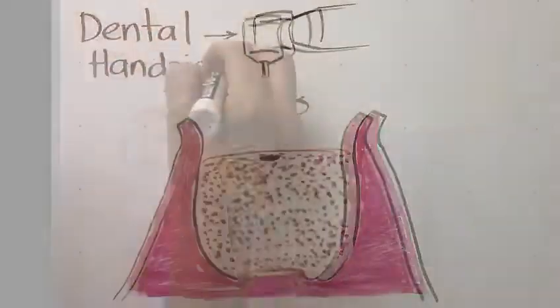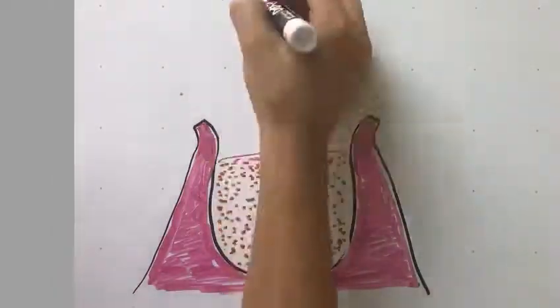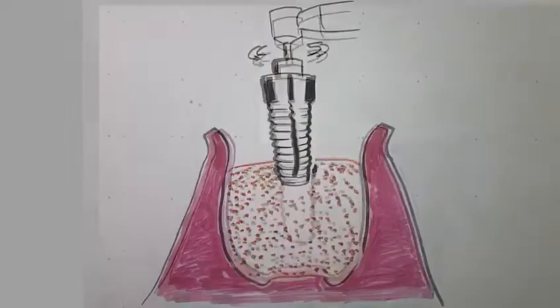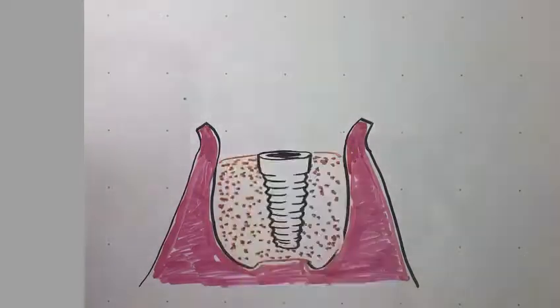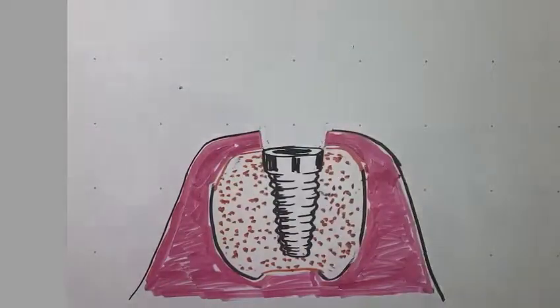The traditional approach is done in phases. To make sure the patient will be able to get an implant, a bone grafting procedure is sometimes done on the area where the tooth is missing. Once the graft has healed, the first phase involves the surgical placement of the implant in the jaw. The dentist gradually prepares the site and places the implant.